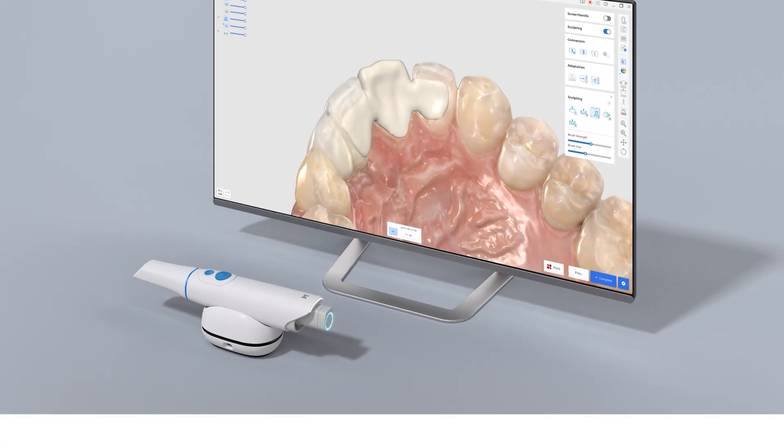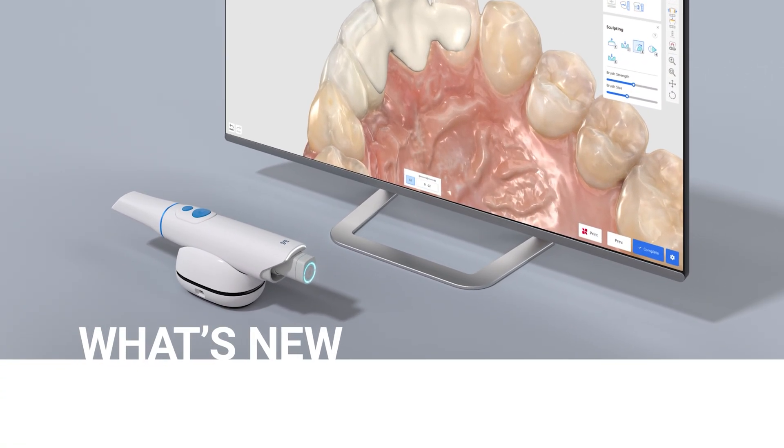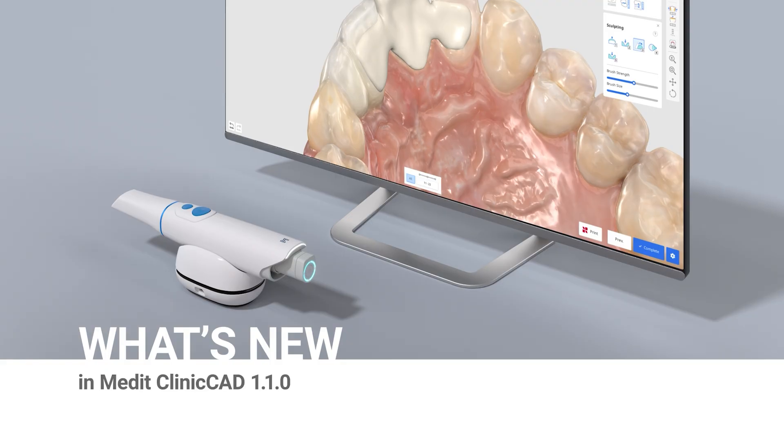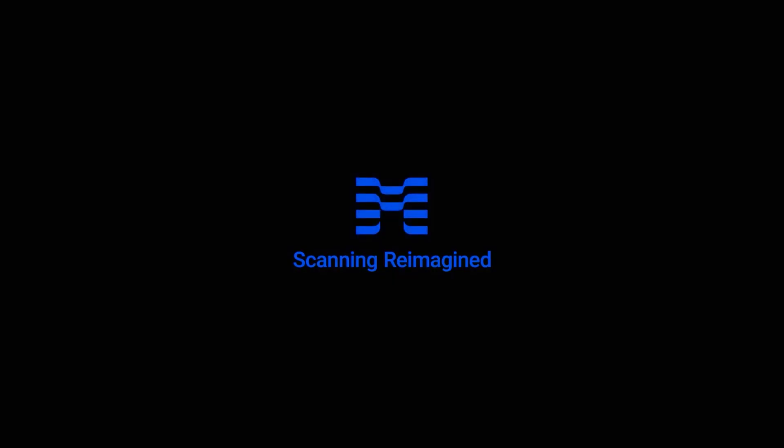We have briefly introduced six updates in Medit Clinic CAD version 1.1.0. Learn more about digital dentistry with Medit Academy.